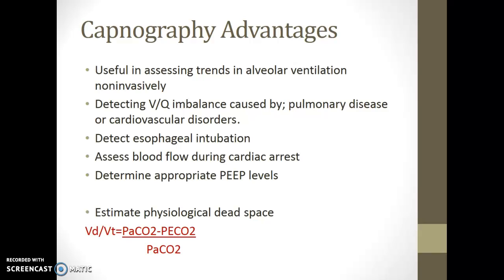You can very easily and quickly detect an esophageal intubation. If the patient is intubated in the esophagus, your end-tidal CO2 reading would be 0%. Or if you're using an Easy Cap, it would stay that purple color and not turn to yellow because you're not getting any carbon dioxide back from the patient if the tube is in the esophagus.